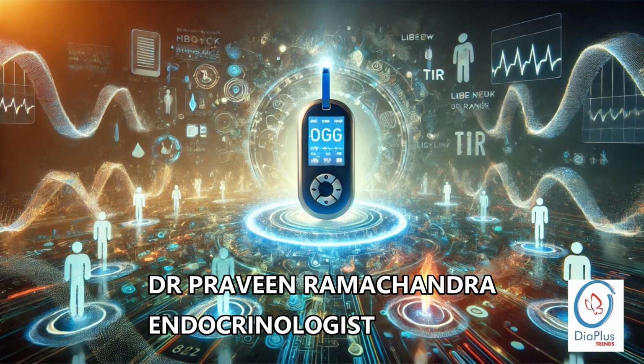Well, you can have two people with the same A1C but vastly different experiences. One person might have really stable glucose levels within a healthy range, and the other might be swinging high and low all the time. Wow. Even if it averages out to a decent A1C, all those swings can lead to complications down the road, like eye problems, kidney problems, even heart issues. That's eye-opening for sure. So it's not just about how we feel in the moment, it's about protecting our health in the long run. Yeah, absolutely.